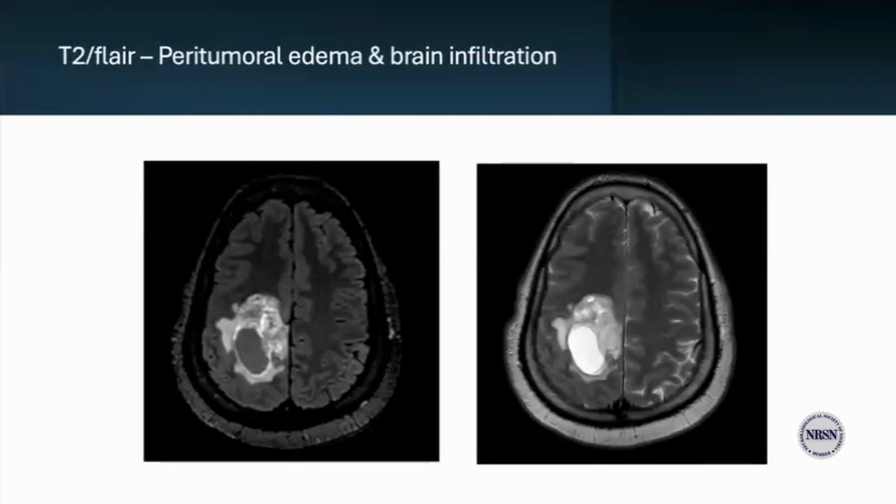So a clinical tip for this: FLAIR is better, as I said earlier, in delineating and enhancing infiltrative tumor margins and subtle white matter changes. And these can be very easily missed or less well-defined on T2. So therefore, both these sequences are complementary to each other. T2 will give us a broad view of fluid distribution, while FLAIR will enhance detection of subtle edema and infiltrative tumor spread.